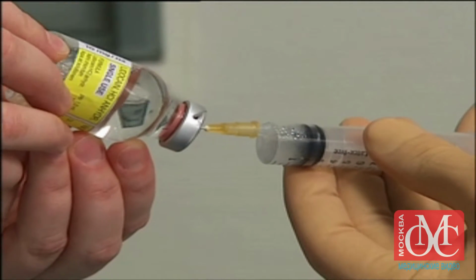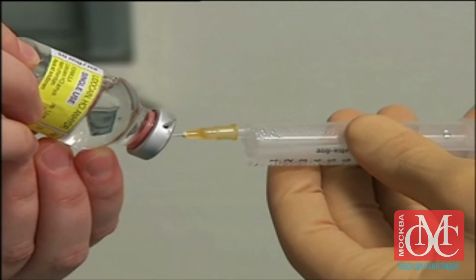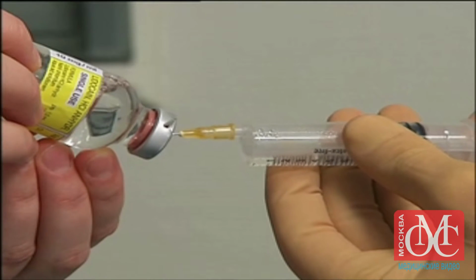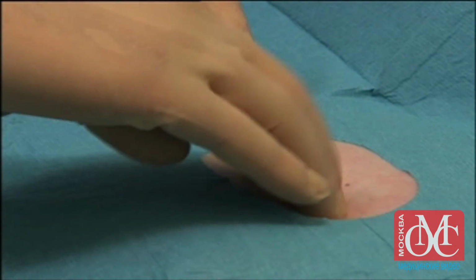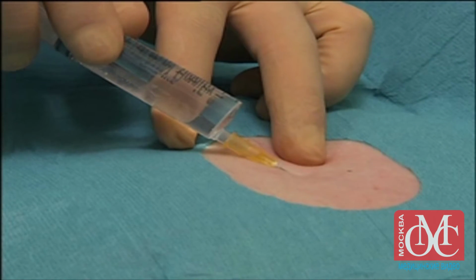Aspirate lidocaine into the 10 milliliter syringe for use as a local anesthetic agent. Using a 25 gauge needle, inject a wheal of lidocaine at the superior edge of the third rib at the midclavicular line.